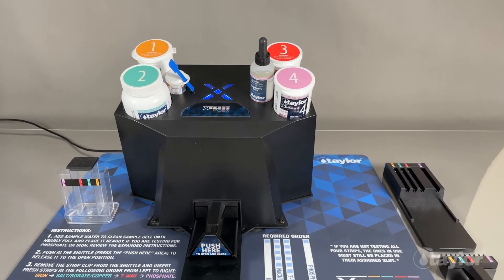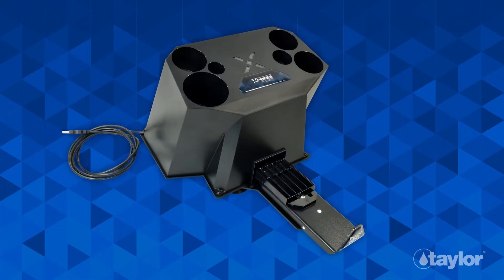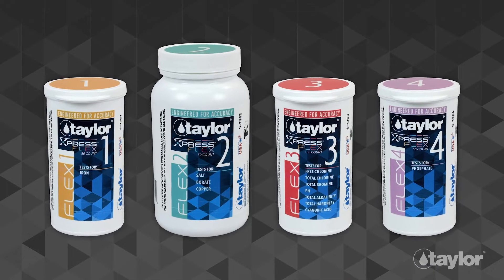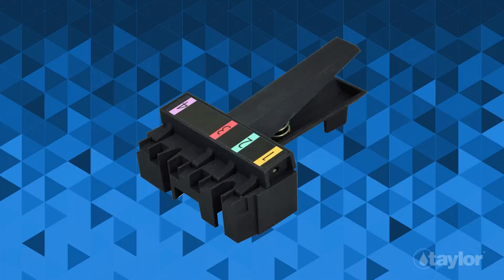The ExpressFlex testing system consists of several components: the ExpressFlex device, ExpressFlex strips, water sample dipping vials, test strip loader, and test strip clips.